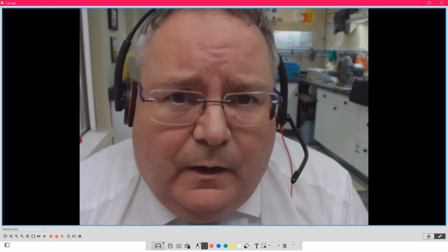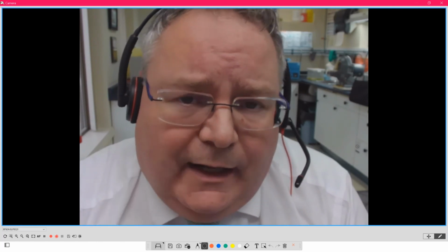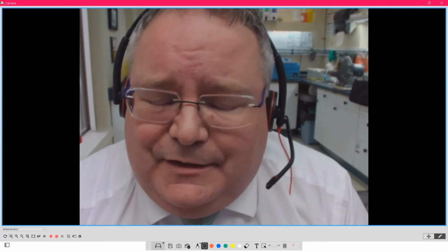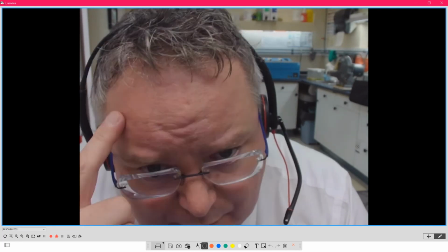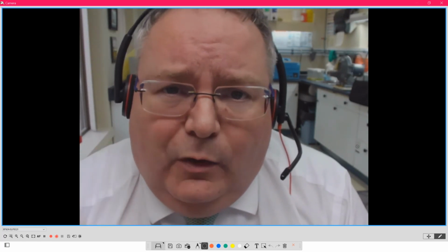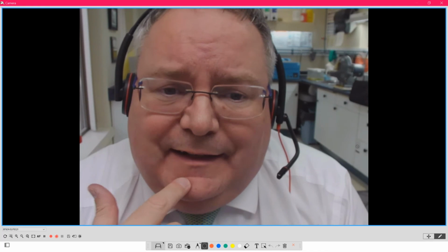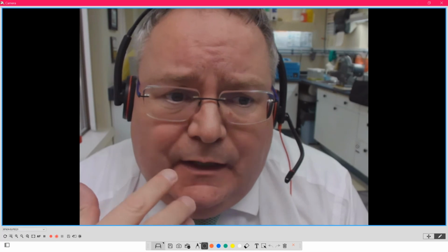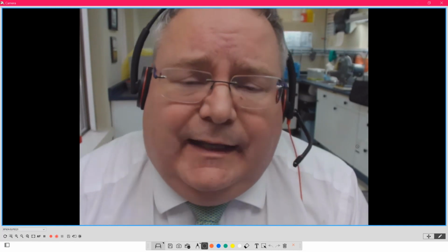So remember my comment. It is not the manufacturer's fault when anterior teeth chip or break. It is not their fault. What happened is that we set them in the wrong spot. Now, sometimes they break because you caught it on the wrong way on the wrong day. Because remember, there's no nerve on that tooth, so the central nervous system couldn't feel it, so it broke. So I can always attribute it to a one-off that today it just hit and broke because it just did. Because again, they can't feel it and they can't tell it's off. It's like walking with no feeling in your feet. And that's what we're asking patients to do with dentures. We're asking them to give us sometimes critical information about Centric. They can't feel their teeth touch.